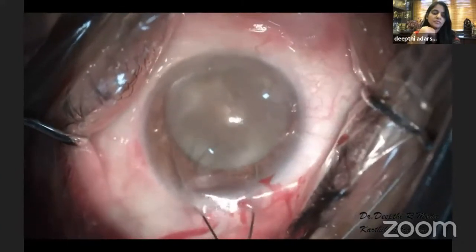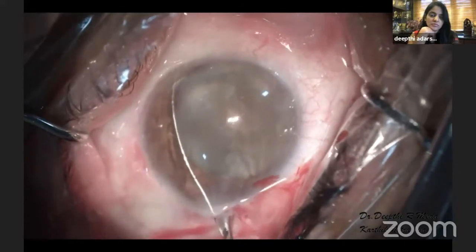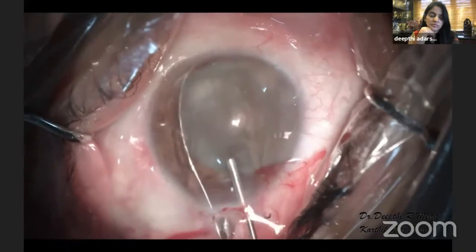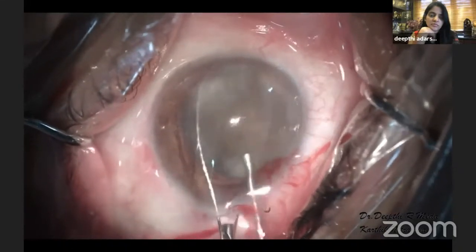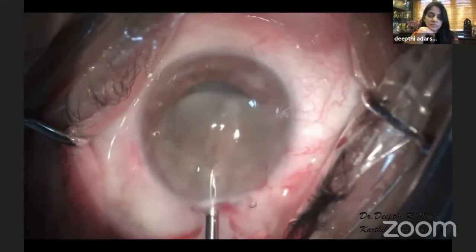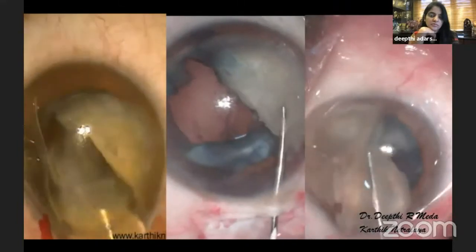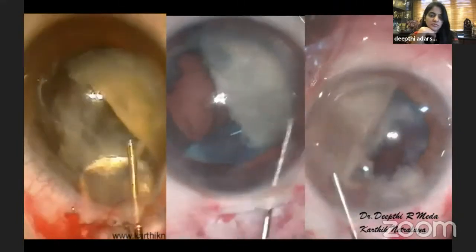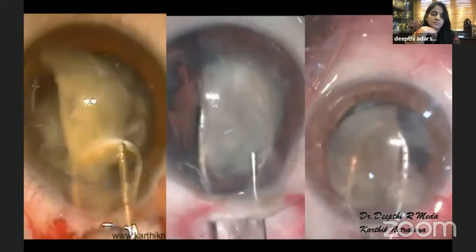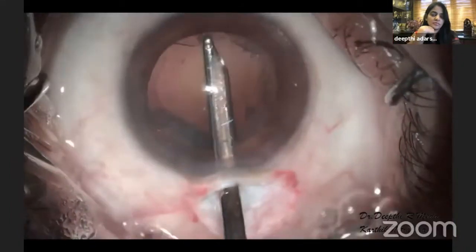So coming to the live video here. Ensure that each movement is very gentle and extremely conscious to avoid touching the endothelium or entangling the iris tissue. A cannula, again continuously injecting visco, is used to feed the nucleus into the snare. These bisected or trisected nuclei can be easily extracted through the 6 or sub-6 mm incision, again using a wire vectis and a cannula that is continuously injecting viscoelastic.